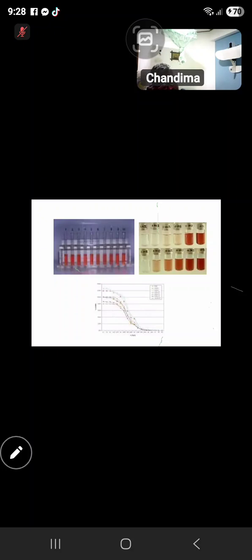Right. In this one, what you have to remember is you have to use the excess amount of solution. And a very important thing is you have to use a control. The control should have the features which I mentioned earlier. It should be the same sex, and a non-related one. Right. That is over. Any questions regarding this?